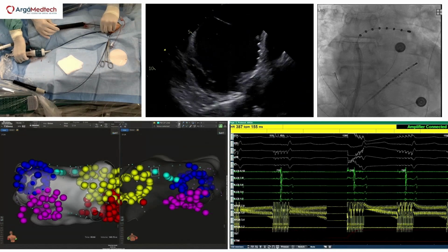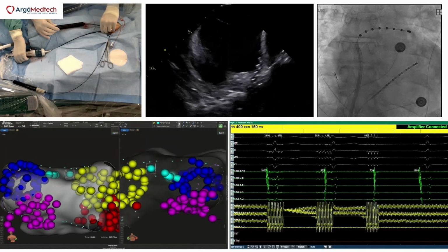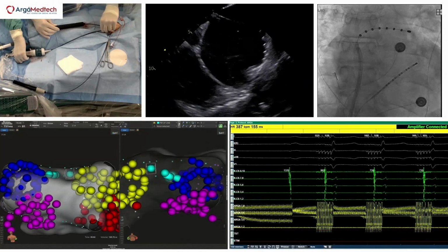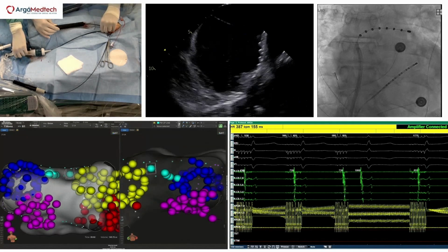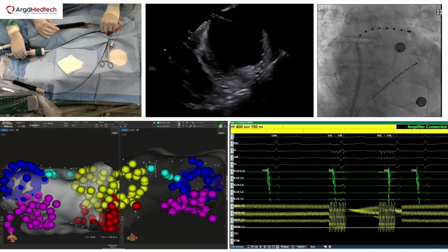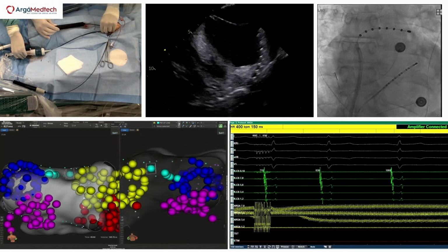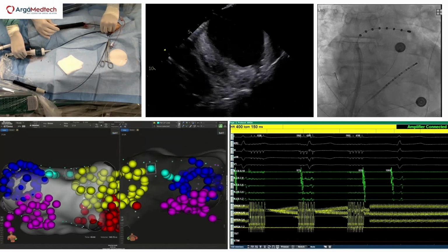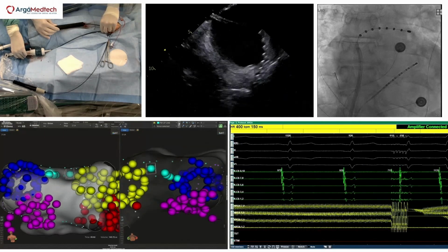You see good contact during ablation. Essentially, we are really ablating where we want. You see, back 4 electrodes are right, extending from the ostium to the central part of the roof. You see on the map that we already have an overlap. It could be that we are done. However, for the durability purpose, because this is the EHRA workshop, Prague workshop, I really want to share next year the remap from this patient.